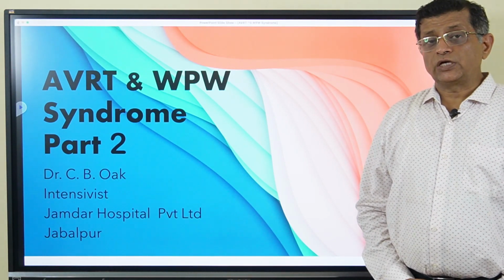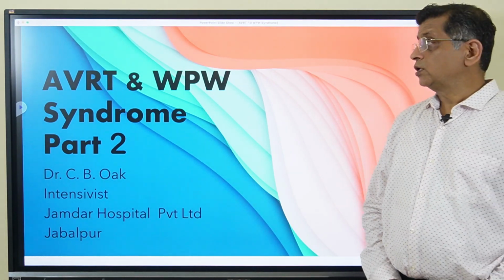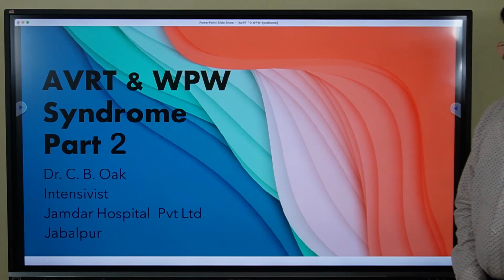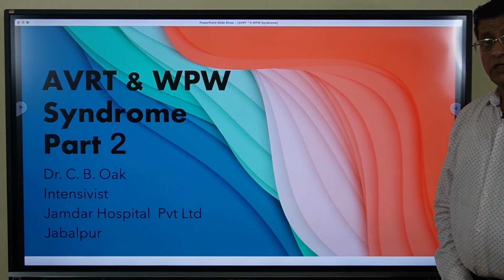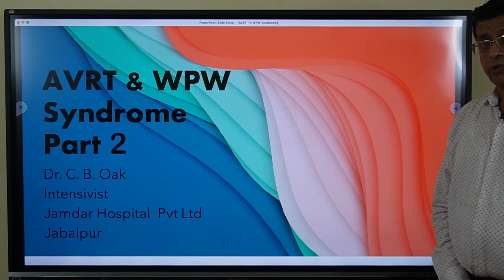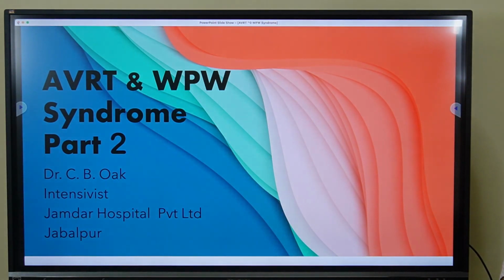In this channel we are running ECG lectures, and this is the 36th ECG lecture on WPW syndrome and AVRT, part 2. In this lecture we are going to discuss various arrhythmias associated with WPW syndrome and the treatment. So let's start with part 2 of WPW syndrome.